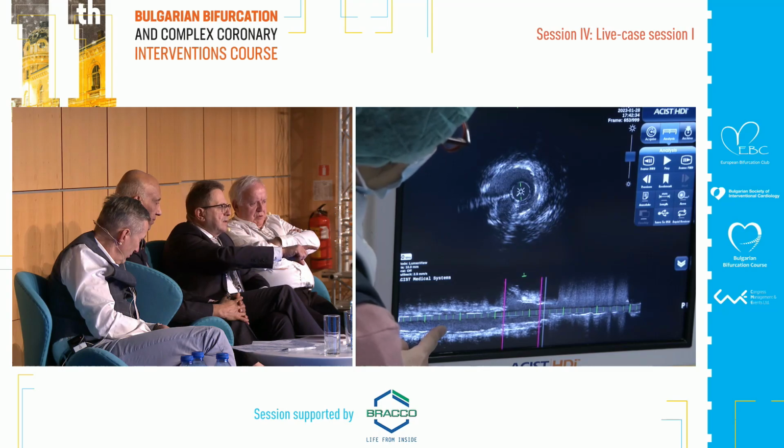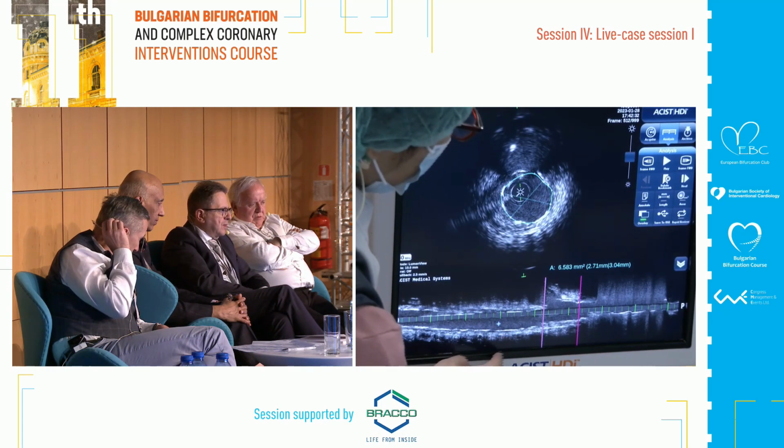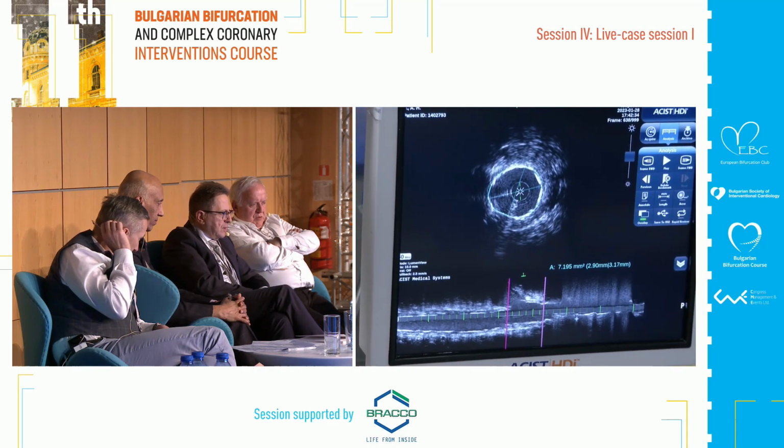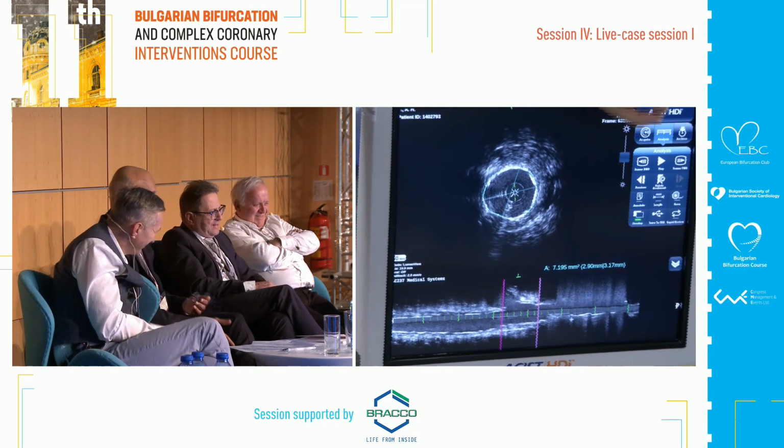Then there's a gap between 12 and 9. Go back to the LAD. Anyway, perfect. Kiko, tell me that it is perfectly okay.